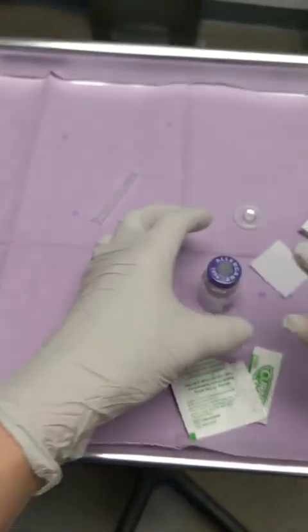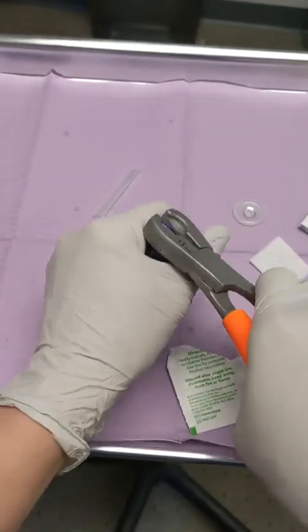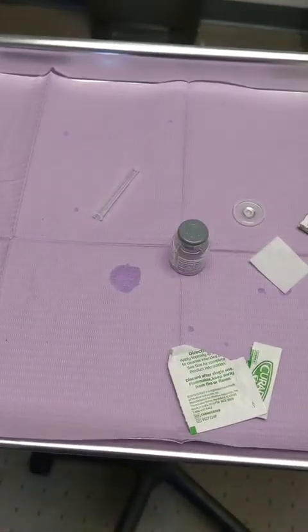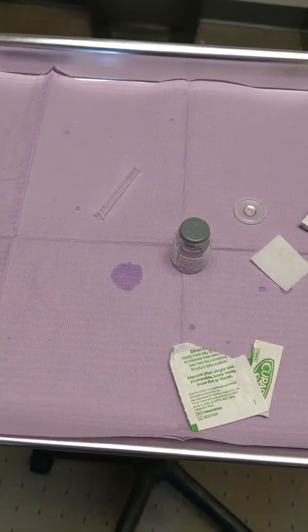This tool is called a decapper. I'm gonna take off the cap so it's easier to draw it up, and so we don't dull the needles.